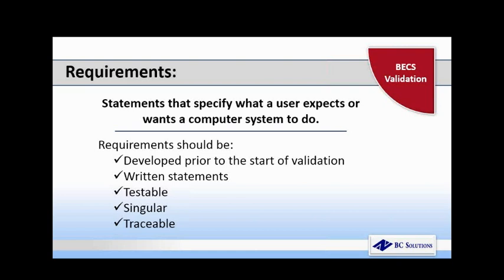Your test case then would be to enter a donor, result that donation with a positive HIV test, and then see if you can get to distributing that unit or issuing that unit to a facility. You may not be able to even label it. Therefore, it is blocked from you sending it out because you can't send out anything that's not labeled. So that's how you would work the requirements that you develop. You can develop requirements. There's no standard set of requirements out there for you to use for validation, and no one specifies what you need to validate itself.